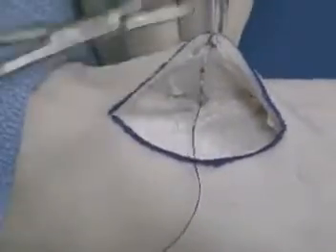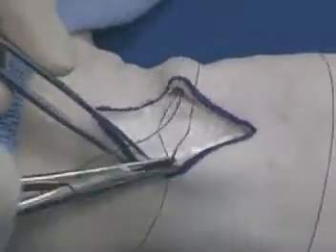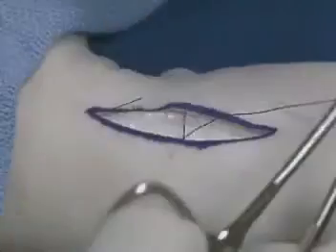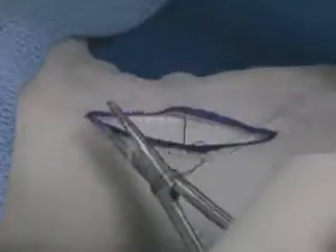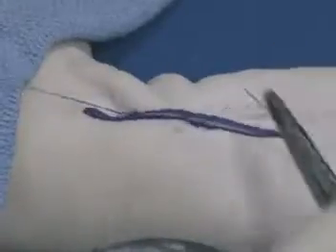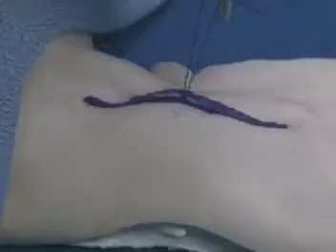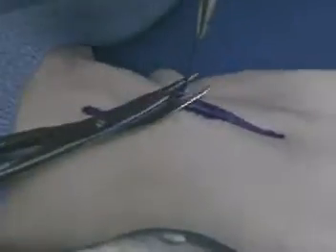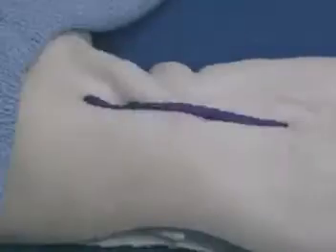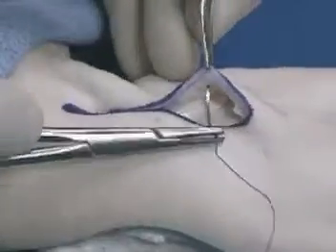The first suture that is placed is a deep suture, and it is buried. It is placed in the dermis at approximately the mid portion of the incision, according to the principles of halving. A surgeon's knot is used to close the deep tissues, thereby approximating the wound edges. Notice how the wound edges come together. The deep suture is cut on the knot, and the wound edges are now well approximated.